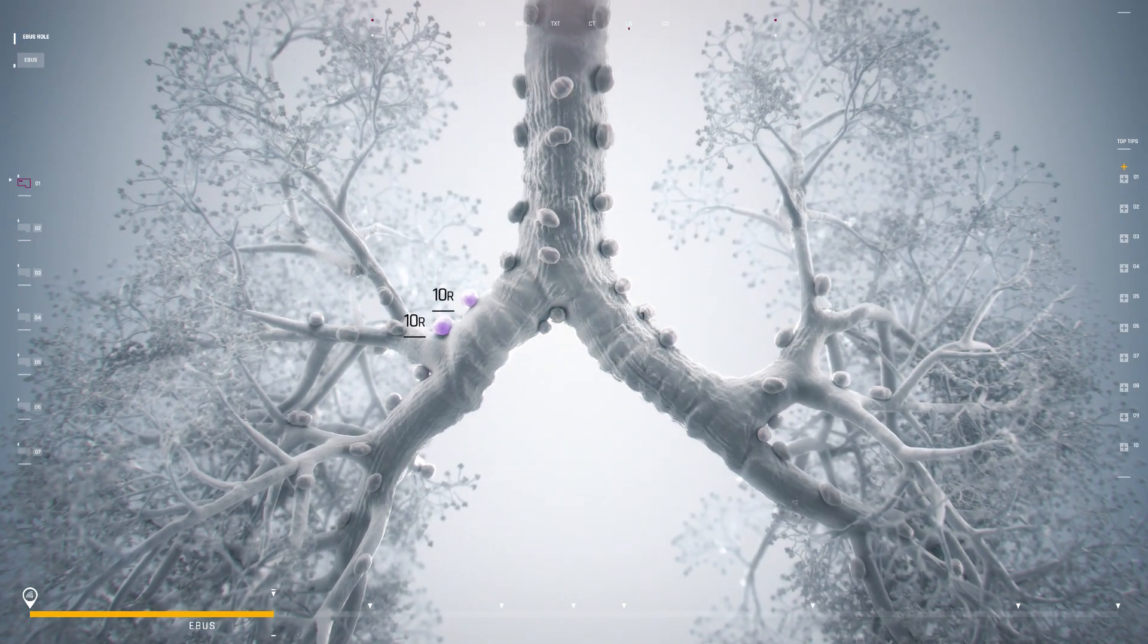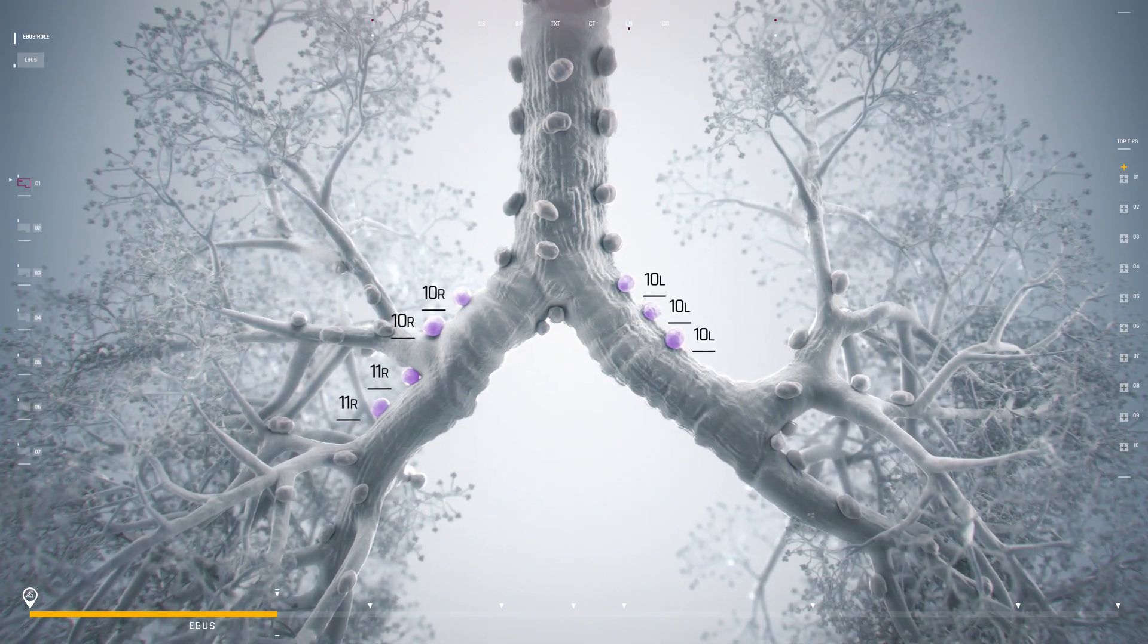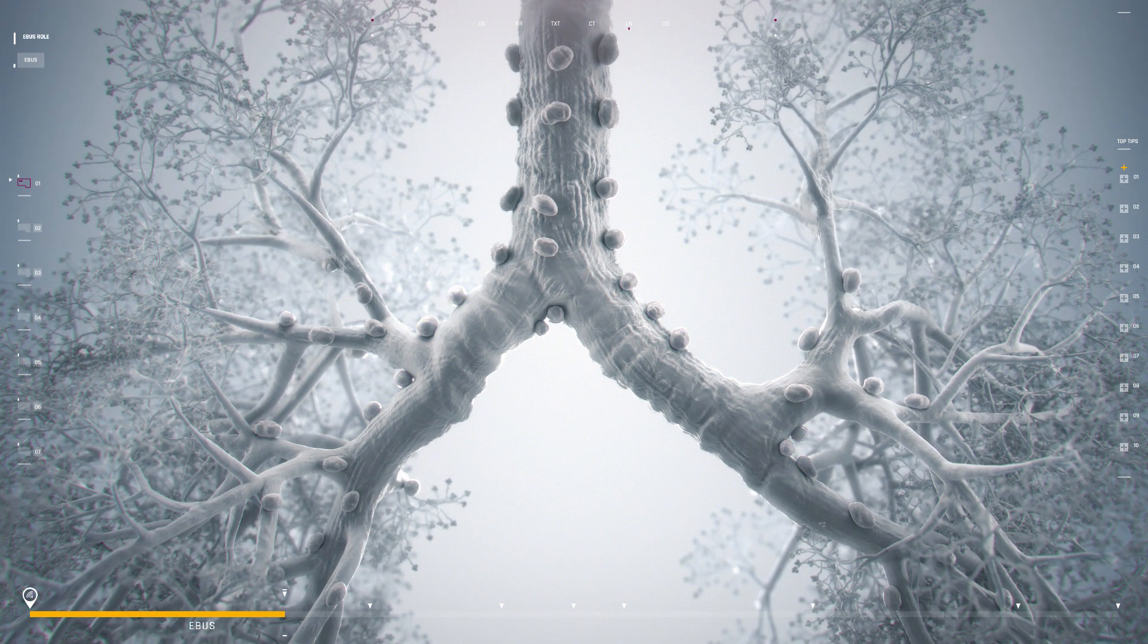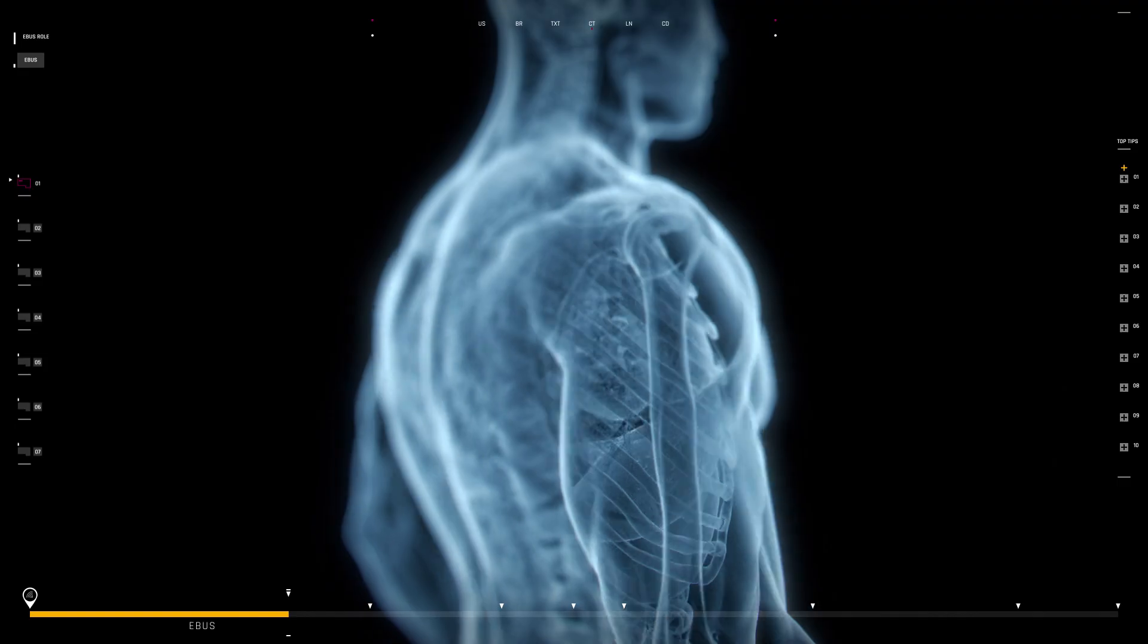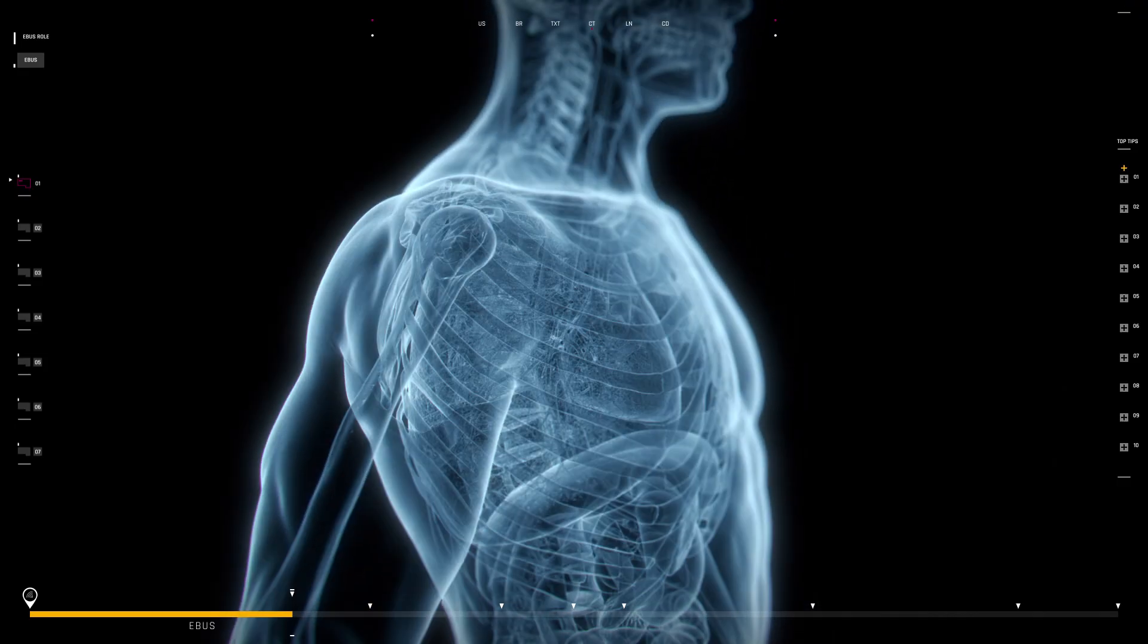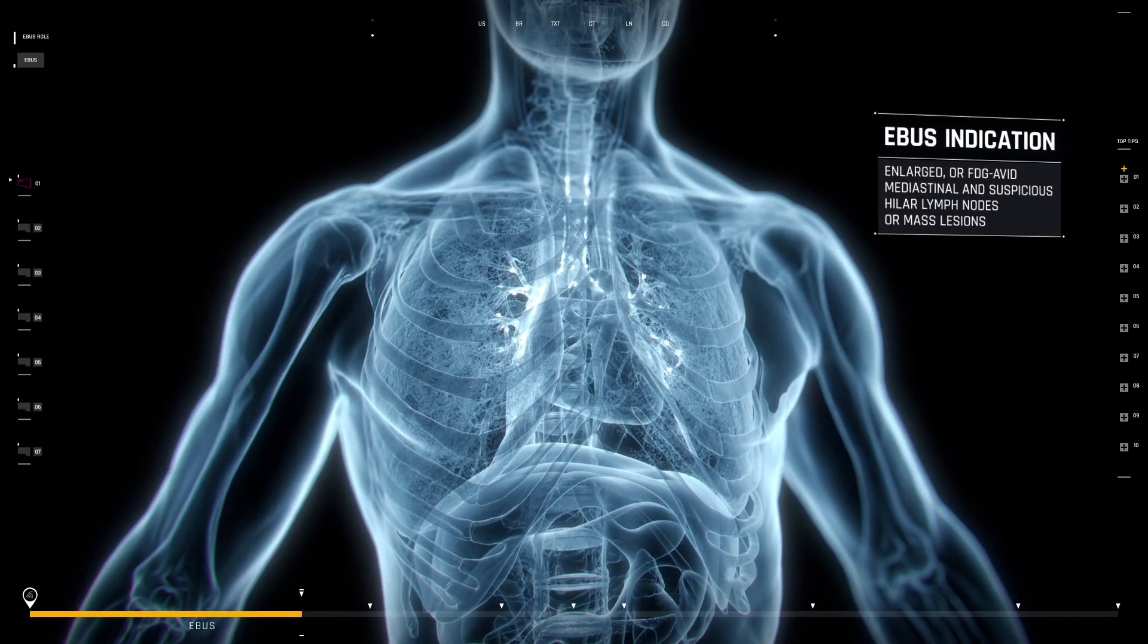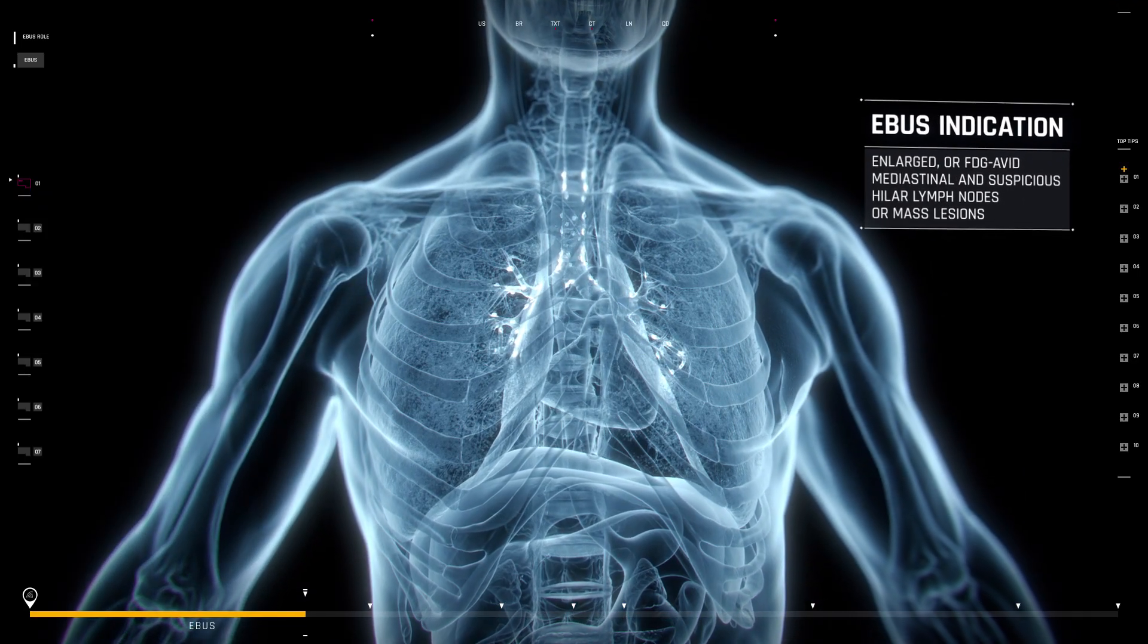EBUS is indicated when initial CT or PET-CT scans display enlarged or FDG-avid mediastinal and hilar lymph nodes, or when mass lesions warrant pathological evaluation.